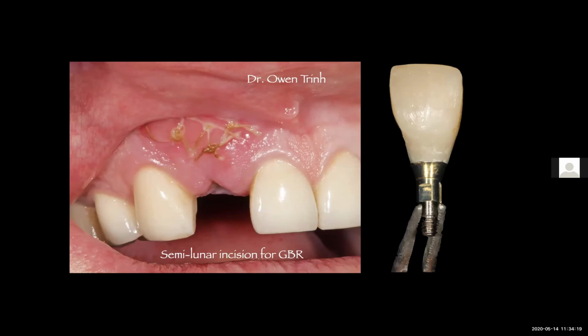And to limit the sedation time and enhance patient comfort, I indexed the implant position at the surgery so that I could fabricate a provisional after the patient left the office. Then the patient returned in 24 hours for the delivery of the provisional restorations, and the gingival tissue was allowed to heal to the emergent profile on the provisional. You have about 48 hours from the time of the implant surgery to when you can insert the provisional.